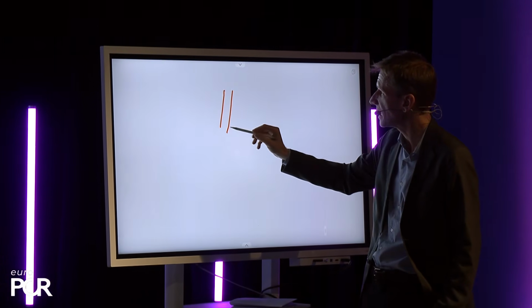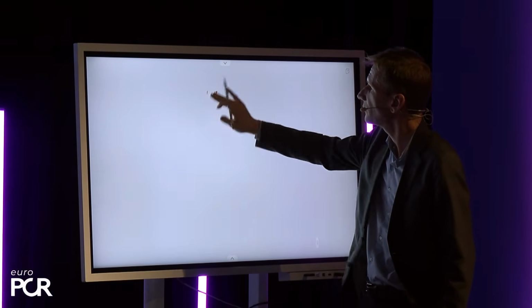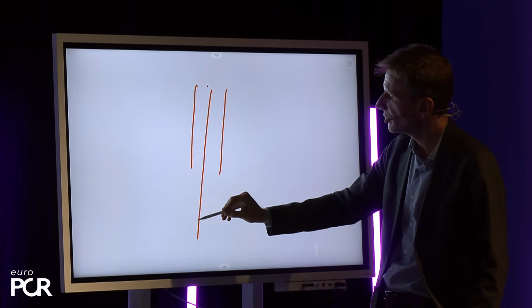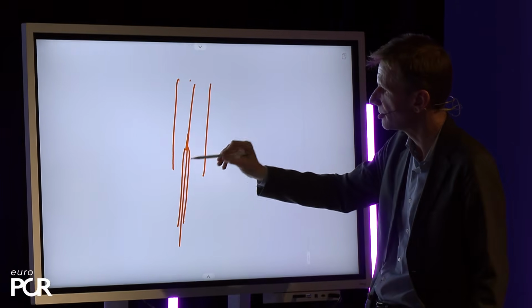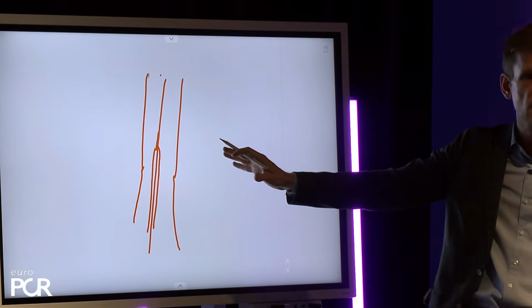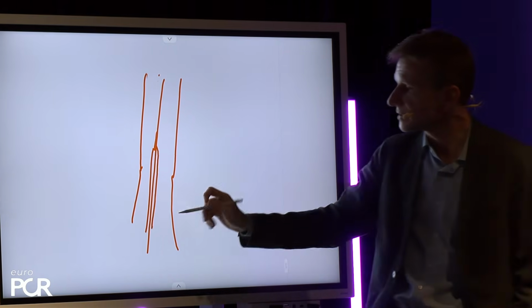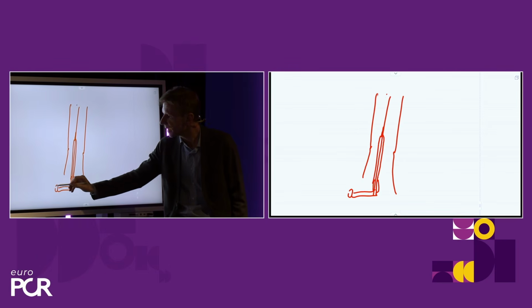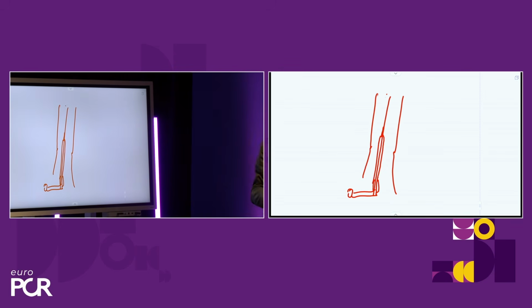So what we do is, at the end, we close. The 18 French comes out. We close, and then at the end, in the artery, we keep a wire, and we reintroduce just a 6 or 8 French sheath. We reintroduce this on this wire, and then typically it's very dry. That's typically a good sign. But then through this 6 or 8 French sheath, you can give contrast very controlled. So it's only 5 cc or so, maximally 8 cc.